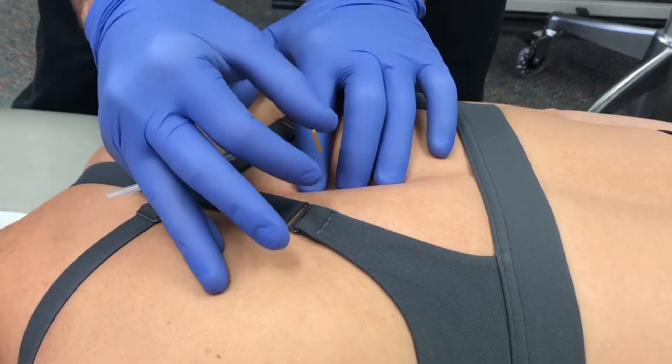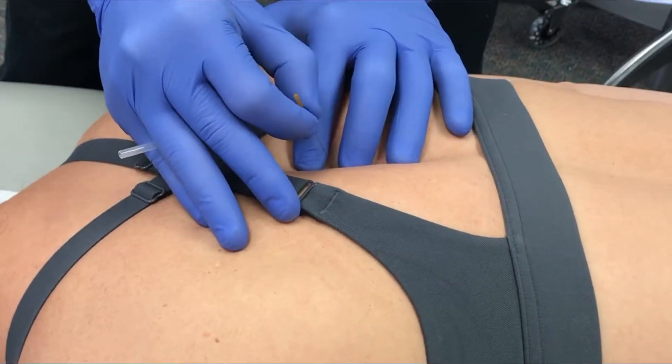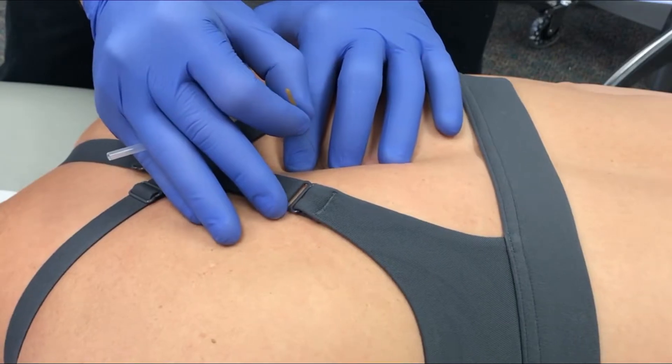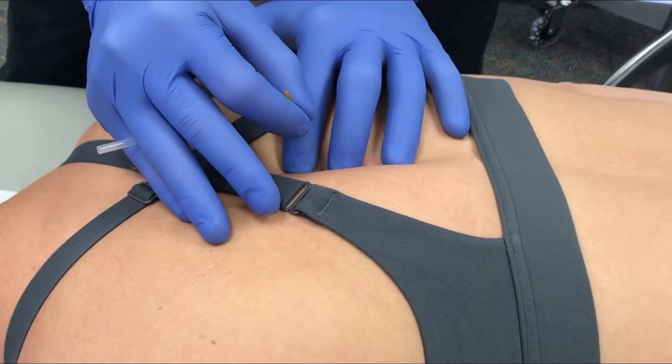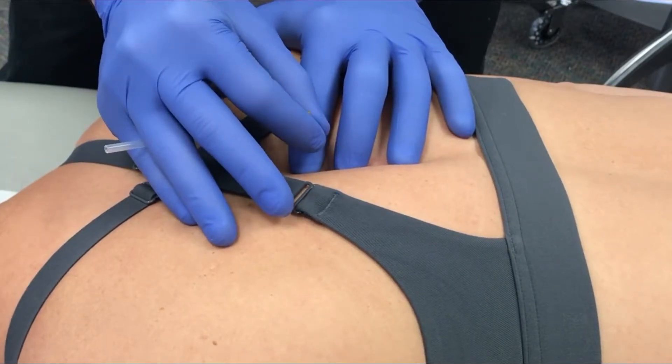Once you insert the needle, do a little bit of pistoning where you first insert, and then come out of the muscle into the subcutaneous tissue. If you're in the subcutaneous tissue, you can easily glide the skin one way or another and the needle will move with you. Then just needle this new area of muscle that you've positioned yourself over.